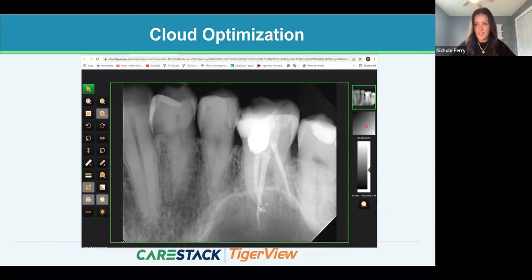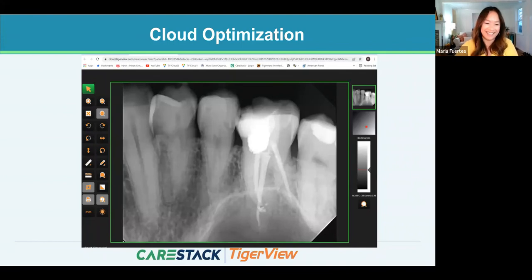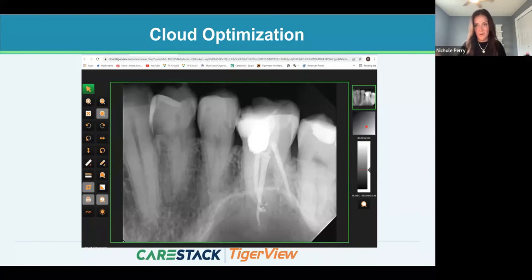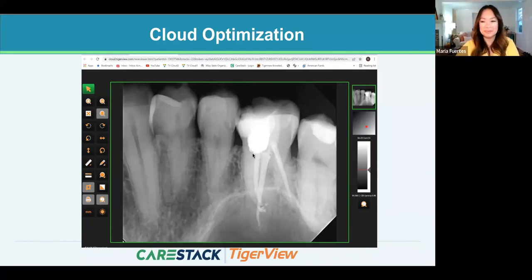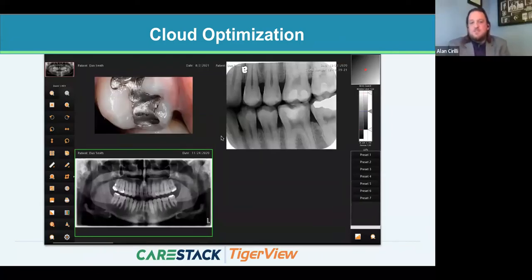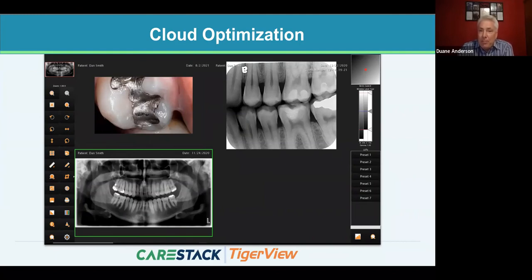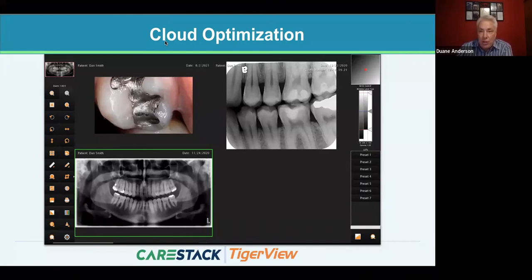Technology has made us so mobile — carrying iPads and laptops everywhere is now the norm. When you open the TigerView viewer window, you have all familiar tools: easily adjusting brightness and contrast, annotating, rotating images, drawing circles, adding text, measuring, magnifying, inverting, and even colorizing an X-ray for those who like that option.